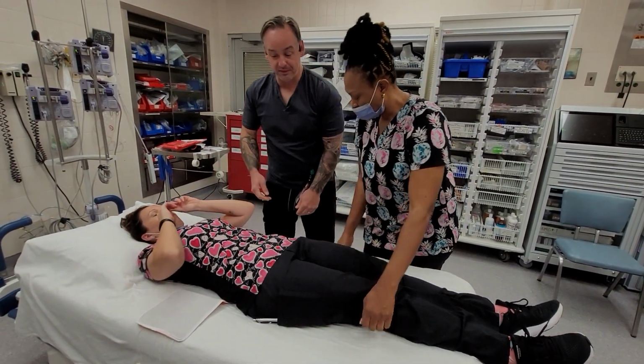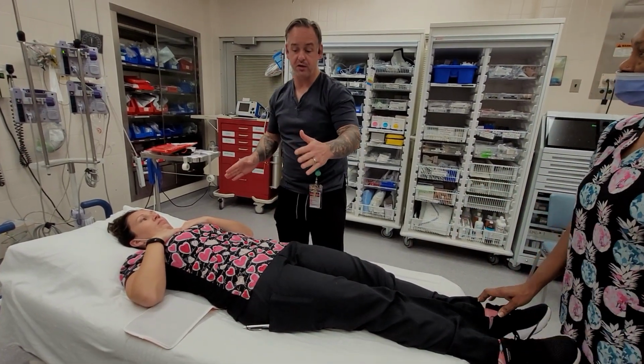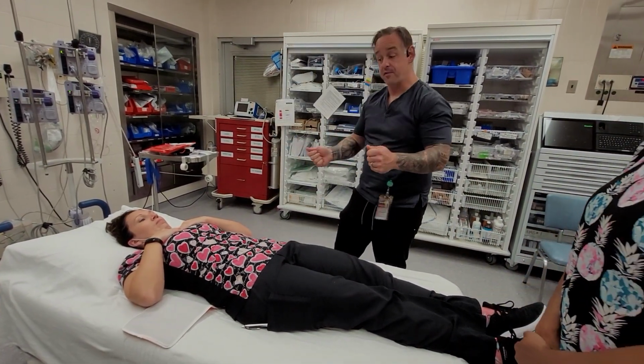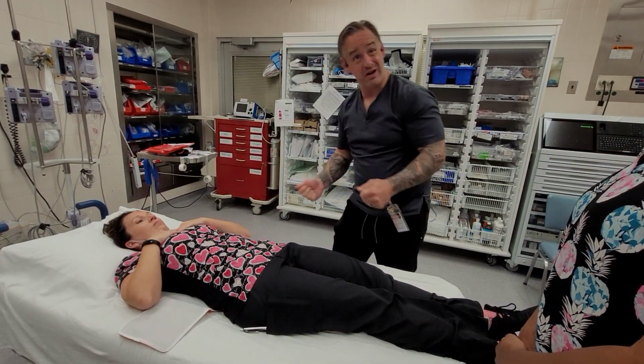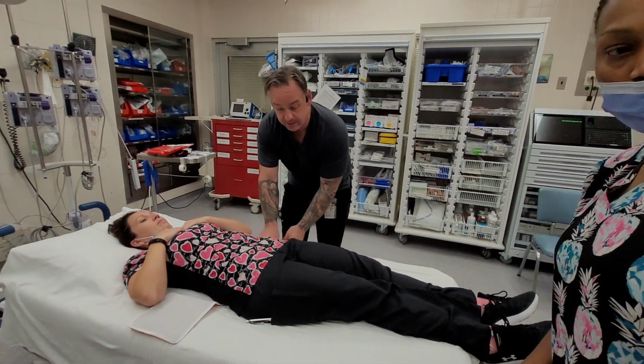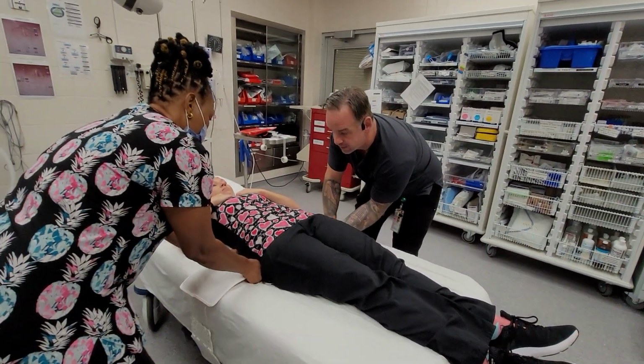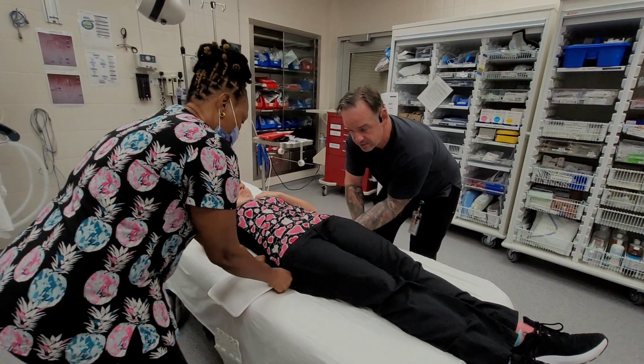So in my placement, I could have put it right at the pelvis when I put it on, but I wanted to show you guys, if you do have a patient where it's up high and you need to bring it to the right level, so you can actually have your partner on the other side. And what you're going to do is you're going to scissor back and forth to try to get it underneath the patient as much as possible.